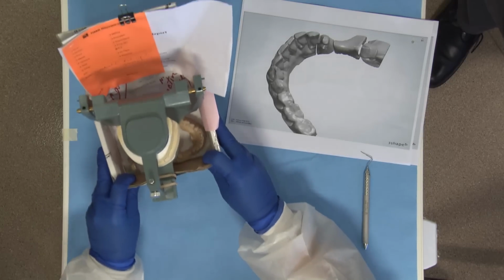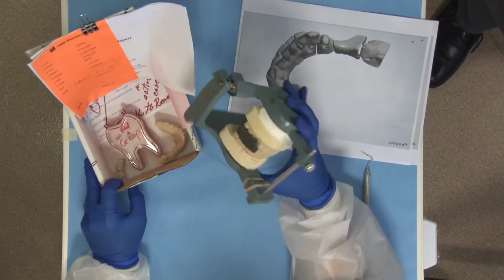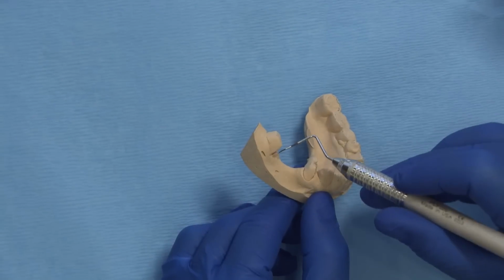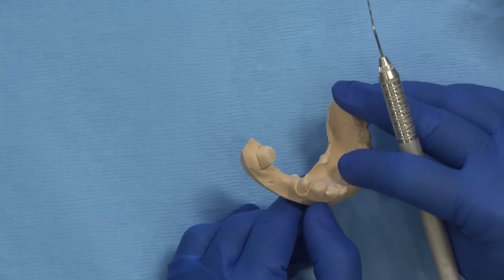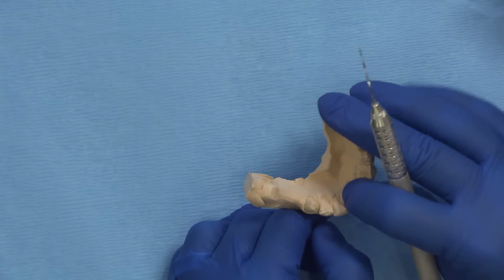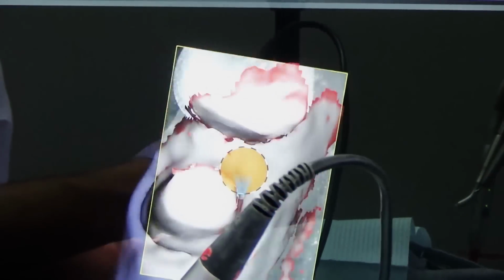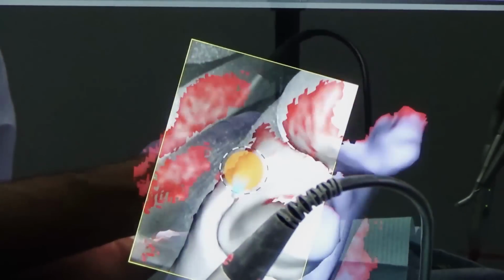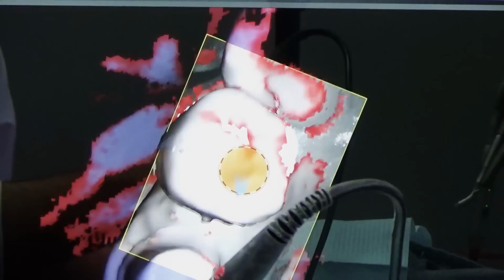We will talk about both of these options using this case one of our doctors sent in. You will see that the draw issue was on the mesial of the molar, very similar to the case I just presented. So, one option that will eliminate guesswork is to take a digital impression and rely on CAD/CAM technology to show you exactly where the undercuts are.